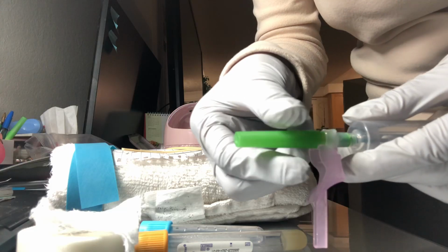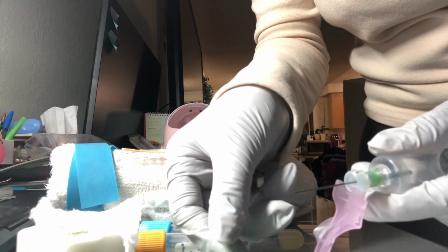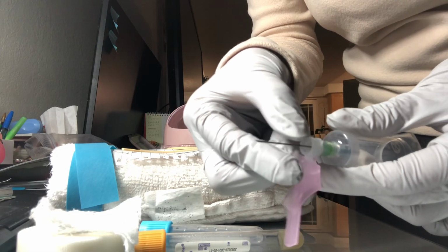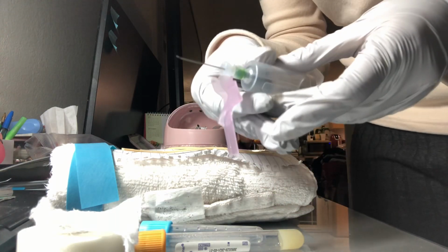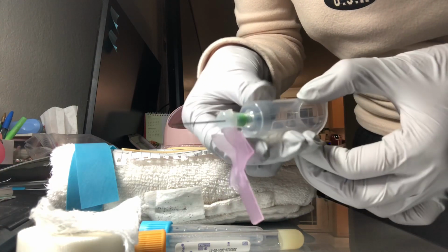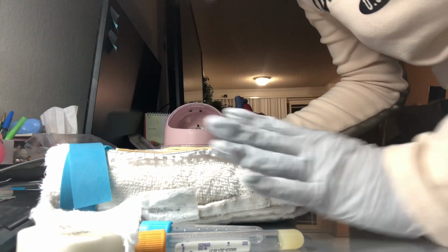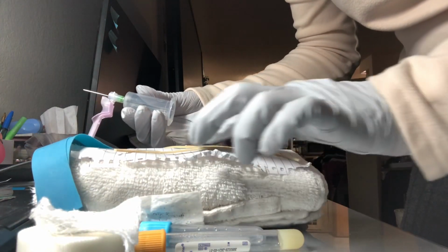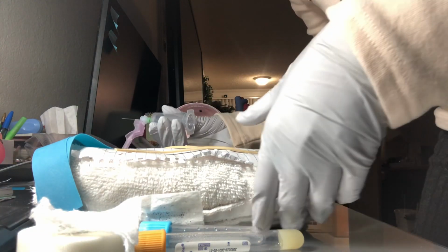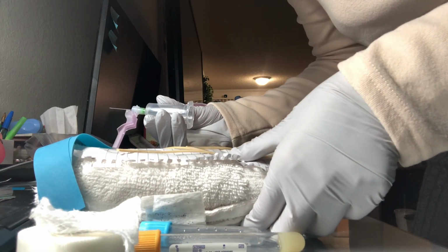And I would like to remove the cap so that it won't disturb the material coat on the needle. So I want to hold it in a manner that better stabilizes the needle. I will align myself to the direction of the vein, like it says here on the cephalic portion of the antecubital fossa, and I want to use my non-dominant hand to anchor this cephalic vein.